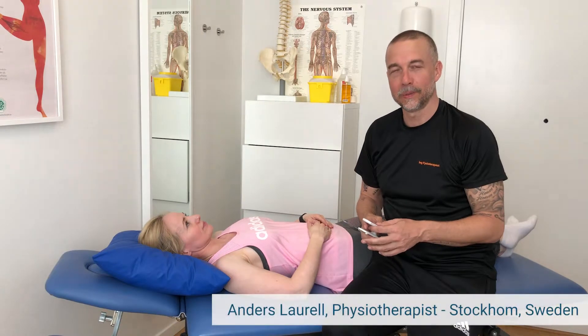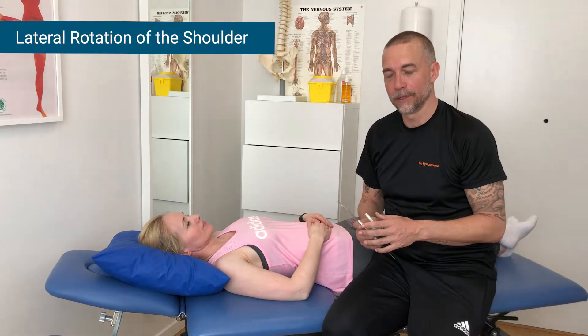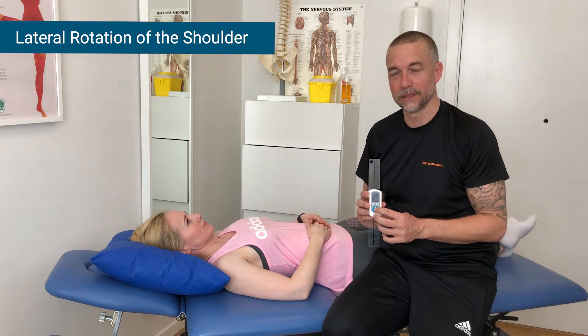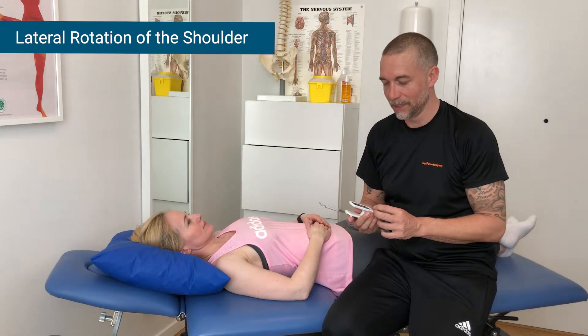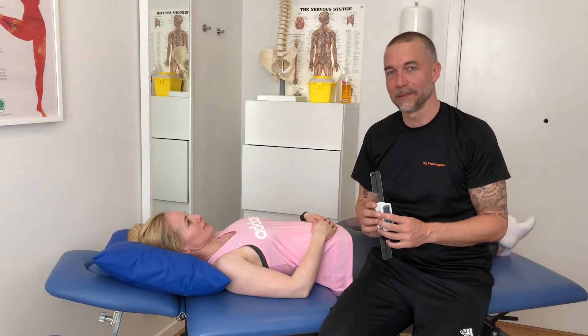In this measurement video, we're going to measure the lateral rotation of the shoulder. I have my device here and I start by pressing the button to get the blinking zeros, which means you're ready to set the plane you want to measure.